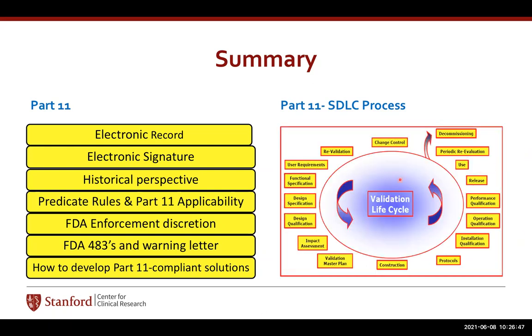And then this summarizes the whole process from start to finish related to building a device. In fact, there are quite a few things even before that, but because of the constrained time, I'll just go over this quickly. The summary, requirement, design, and then impact assessment, which is related to risk assessment.